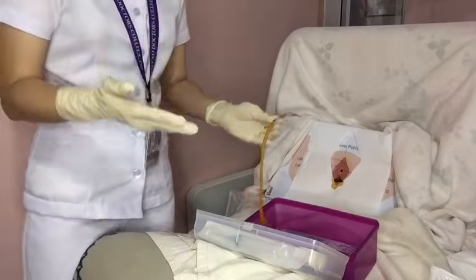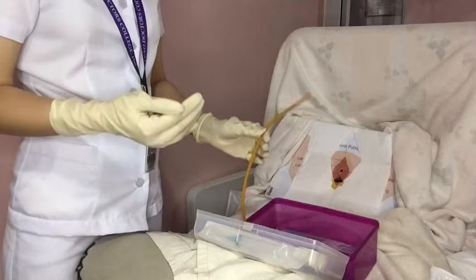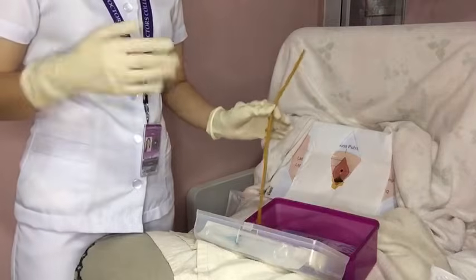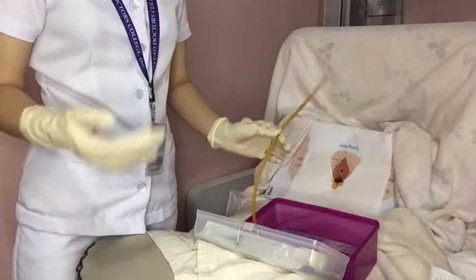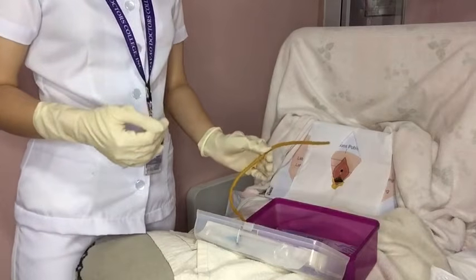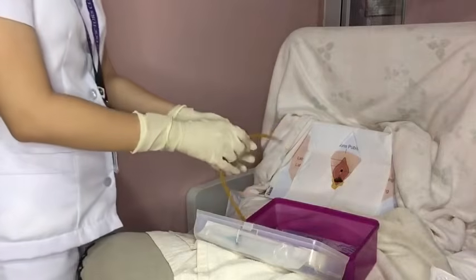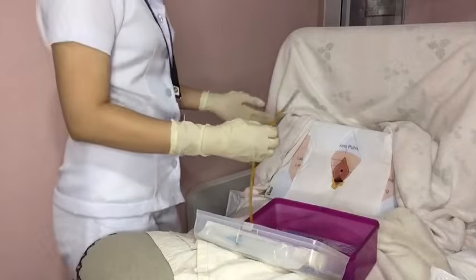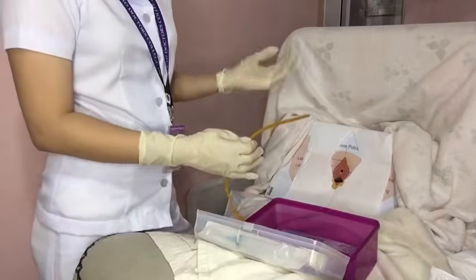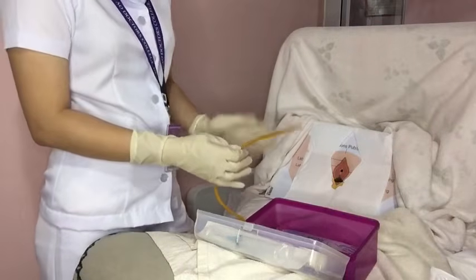Now, pick up the catheter at least 3 inches from the tip. Place the thumb and one finger of the left or right hand between the labia minora, then separate and pull up gently, because separating the area immediately surrounding the meatus helps make it visible. Now let's insert the catheter into the meatus for about 2 to 3 inches until the urine begins to flow. The female urethra is approximately 1.5 to 2.5 inches.